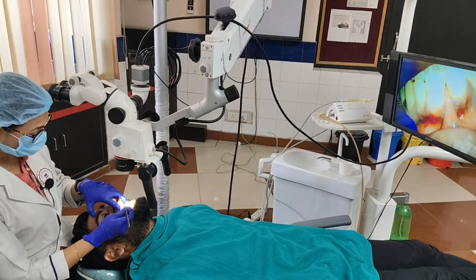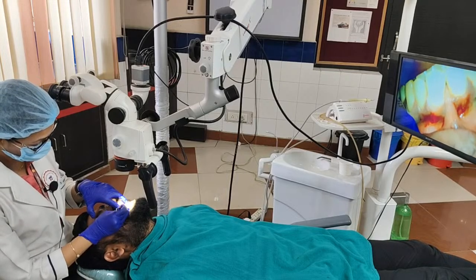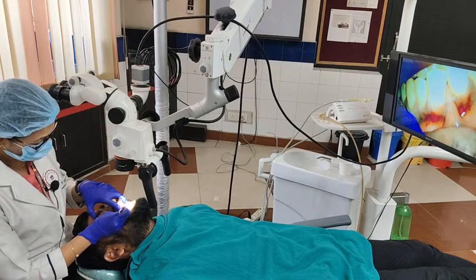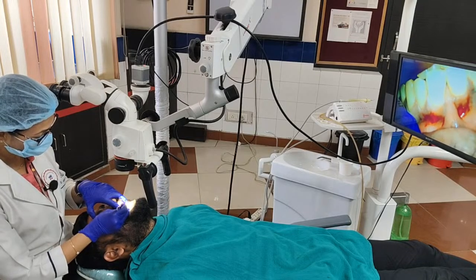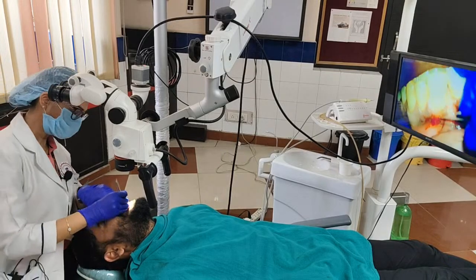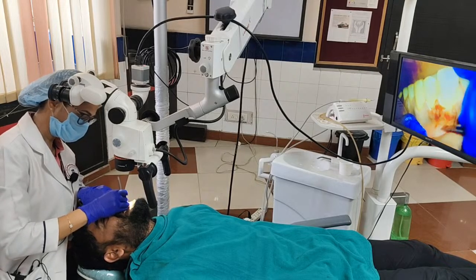Is Harinder ji comfortable? Almost done. Okay. Again here. Where is that pigmentation? Do not unnecessarily strip away the epithelium that does not have any pigments. For this area, I probably need to change the blade.